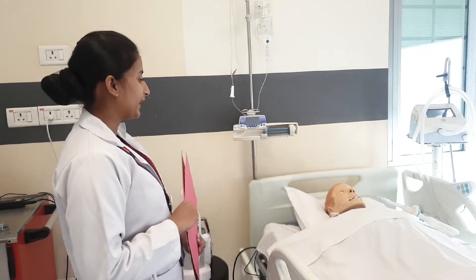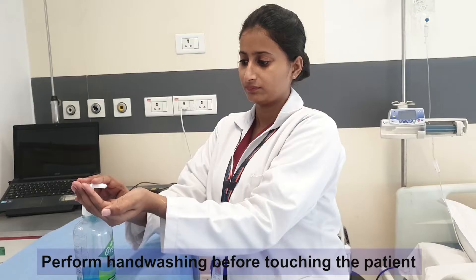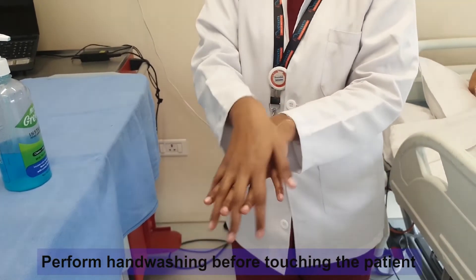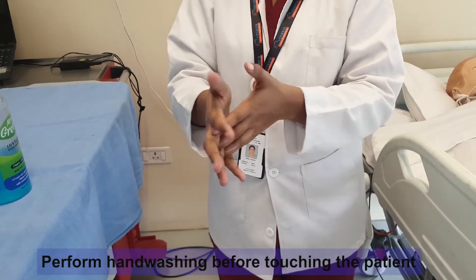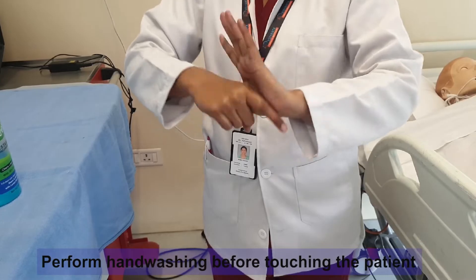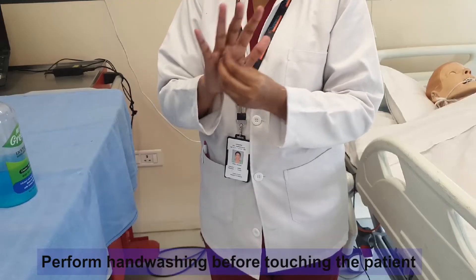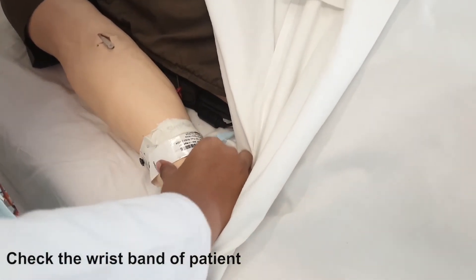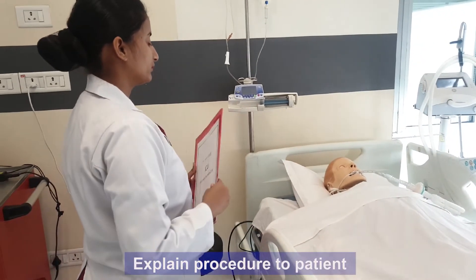Good morning sir. My name is Priya. I am your assigned staff nurse from 8am to 2pm. I am checking your wristband. Explain the procedure to the patient.